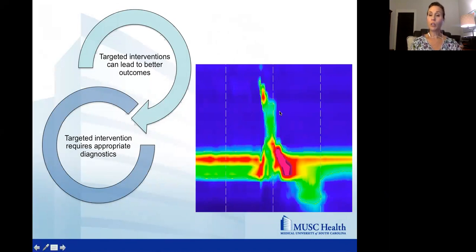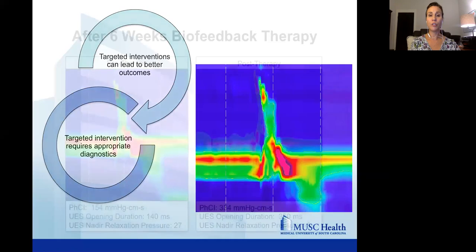But if you look a little bit more closely, what you'll see is there's actually, in this mesopharyngeal region, Kate and I used to call this the tongue-base region, but more appropriately, others in the literature, etc. have adopted the practice of calling this the mesopharyngeal region because it represents really mostly the middle pharyngeal constrictors, probably some of the superior and inferior, but also the tongue-base retraction. And if you look here, this is a little weaker than we would actually expect. In this area, we would expect to see some of those higher colors like the yellows maybe coming into here, and maybe even some of the red denoting higher pressures in that mesopharyngeal region.